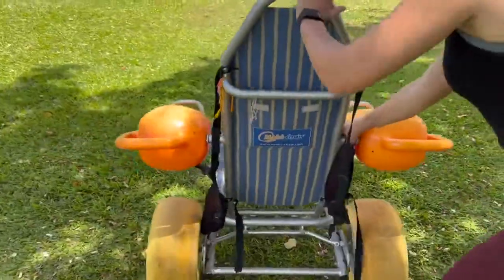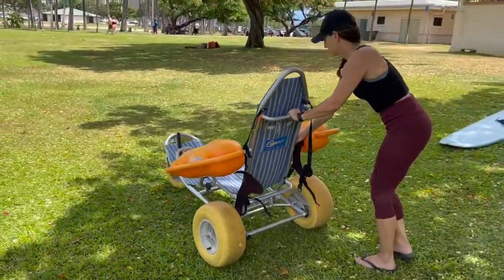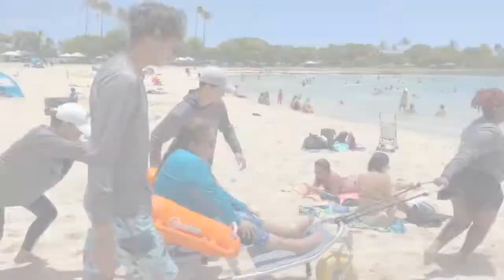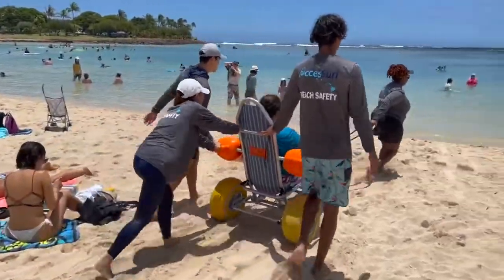The frame of the chair is stainless steel and provides strong points to hold when pushing or pulling the chair. Avoid pushing or pulling the chair from the orange parts of the armrest. There should be one volunteer at the front of the chair, one in the back, and one on each side.